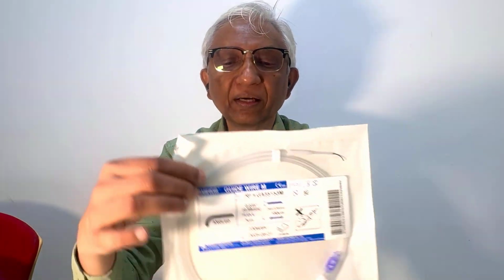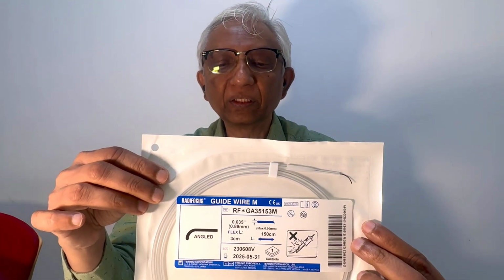But when you want to do an exchange maneuver, you have to use exactly double the length, because that portion of the wire has to stay inside the body when I take out the catheter, and then I take the catheter across. So let me show you the covers to show you what are the typical lengths and how they are written. It's important to remember this fundamental: my guide wire has to be at least 50 cm longer than the catheter. See, have a look at this cover. Can you see the length that is written over here?